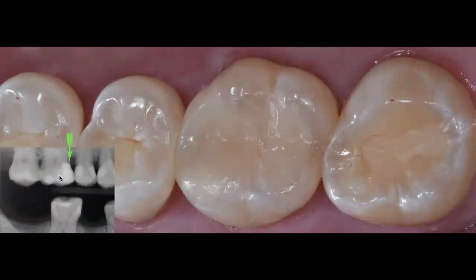But most importantly, you can also see a little bit of the shadow that's created because of the fiber that I place within that tooth. And now you can see that this shadow is not a bubble. This shadow is very nice and uniform, and it actually has the same C shape that I gave that fiber when I was placing it within that restoration, so that I can reinforce my restoration and give this patient a good 15 to 20 year long span of this completed direct composite restoration.